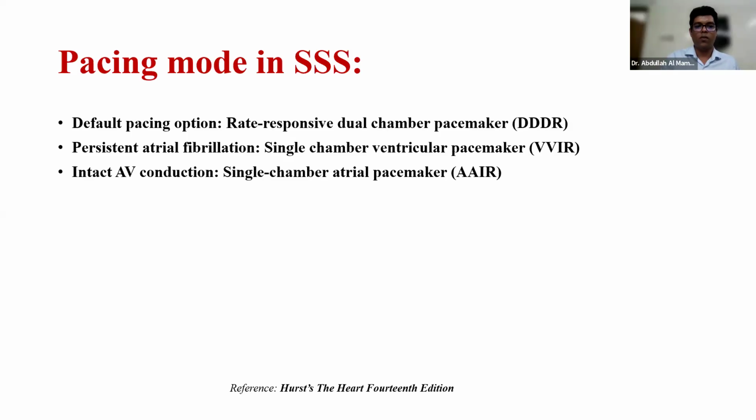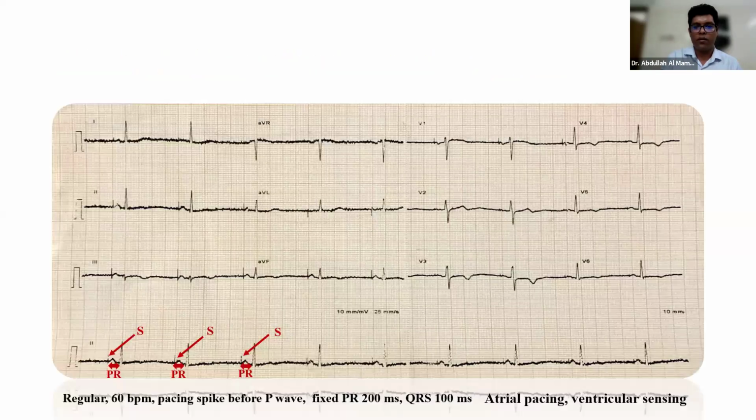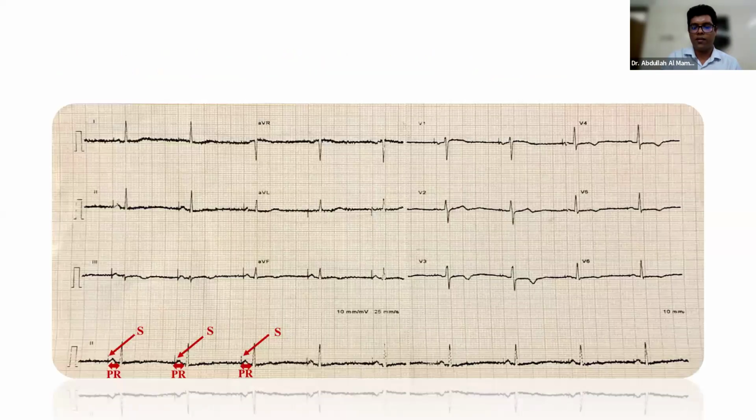Yes, sir. Abdul Zaman sir. Did the Holter monitoring show any episode of atrial fibrillation? No, sir. Okay, there was sinus rhythm.